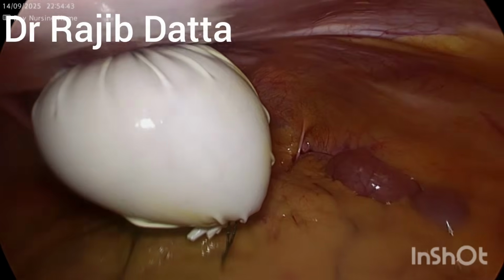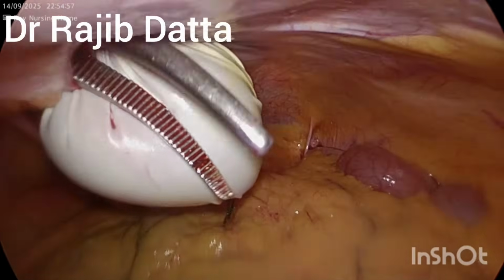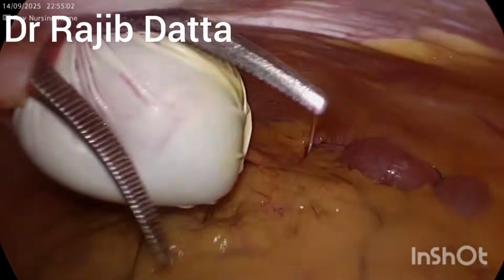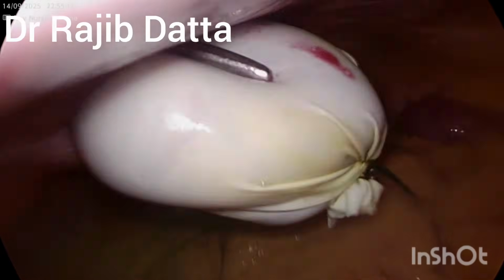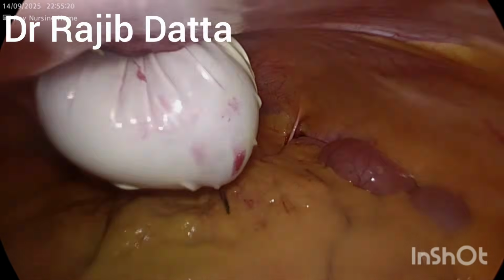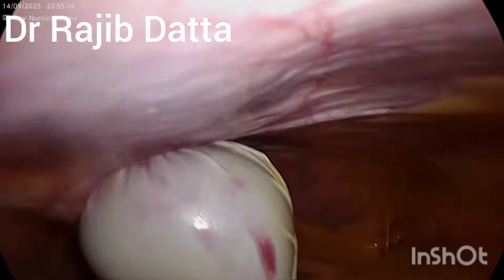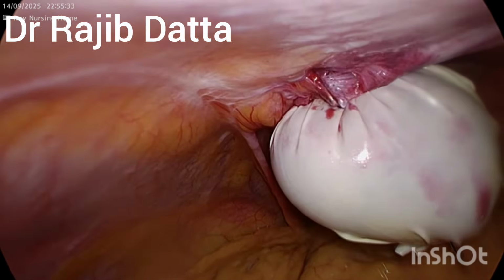That's why I am going to dilate the tract. So with the help of the large cardiovascular forceps, now the gallbladder is also getting stuck here, and it takes time and proper patience for specimen retrieval.